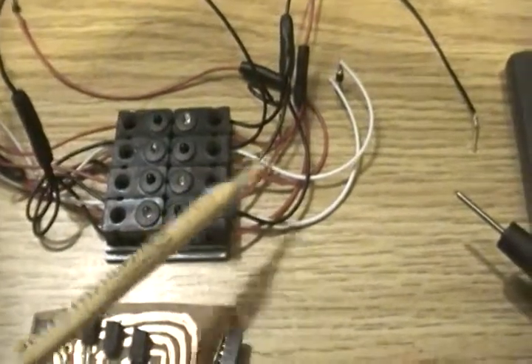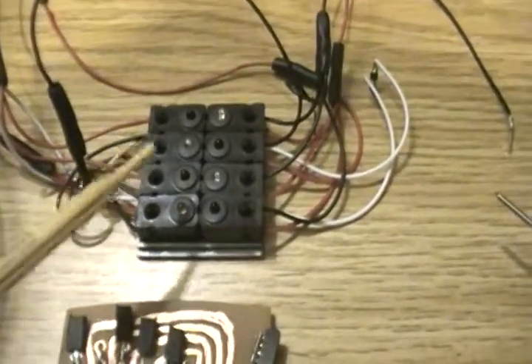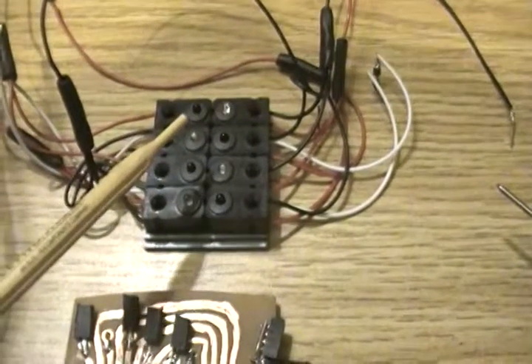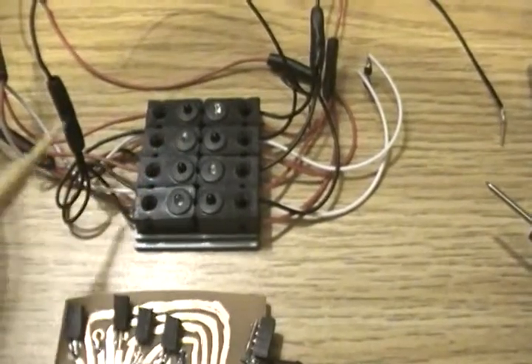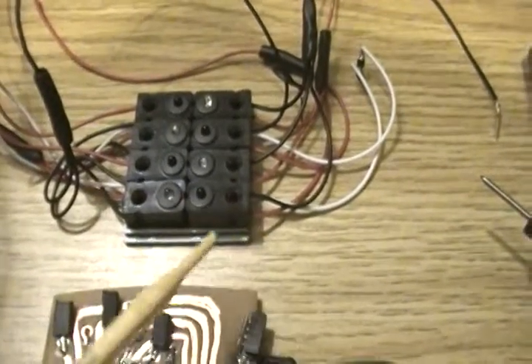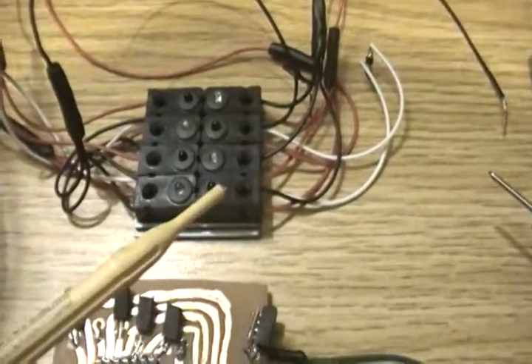Now, the red wires that come out of this, you have them 2 by 2 connected. On this side here, you have the two phototransistors connected together, the red wire into one red wire, and the two red wires from the LEDs are connected to another red wire. And the same thing on the other side. So the red wires go 2 by 2 on each side.